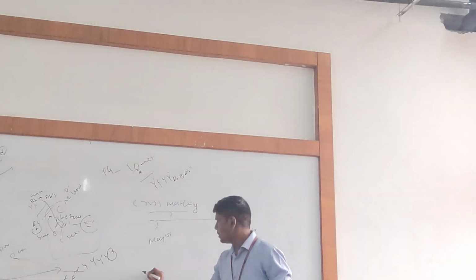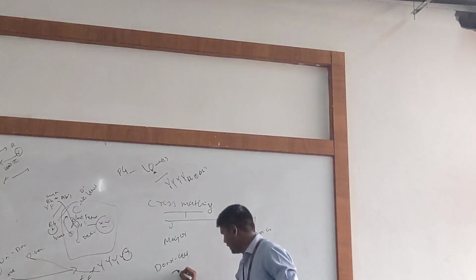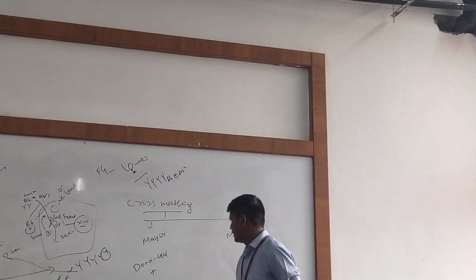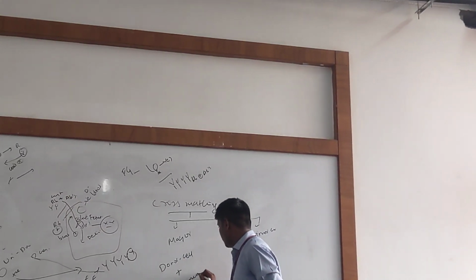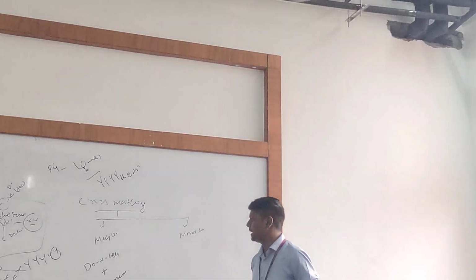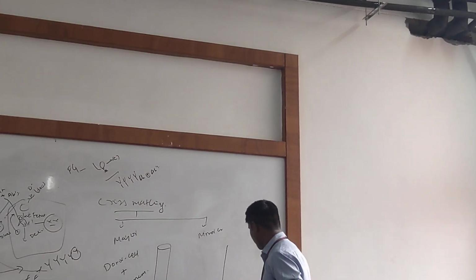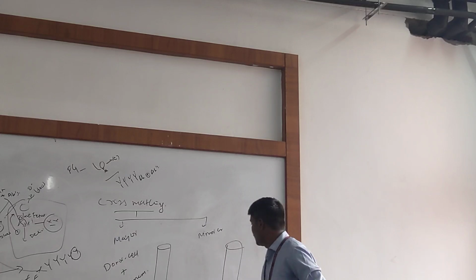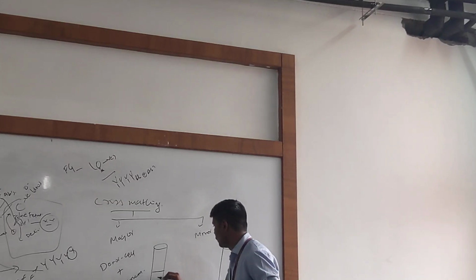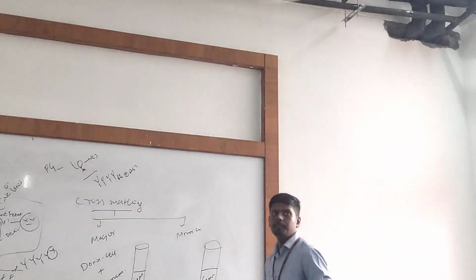In major, write down this concept, okay. Donor cells will mix with recipient serum. Donor cells are mixed with recipient serum. I will draw two test tubes here. This is a test tube. This is a test tube. This is a donor test tube, and this is recipient test tube. Now these are red blood cells, and this is supernatant. That means serum. And again, red blood cells, serum.